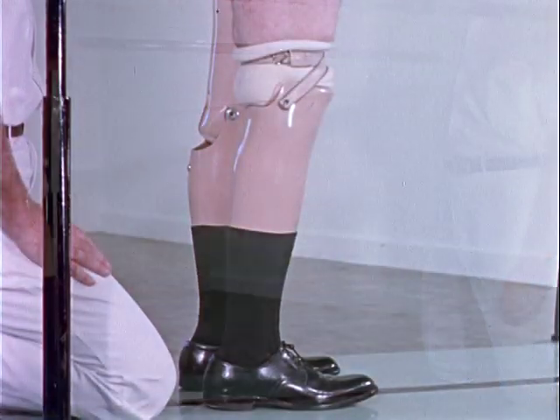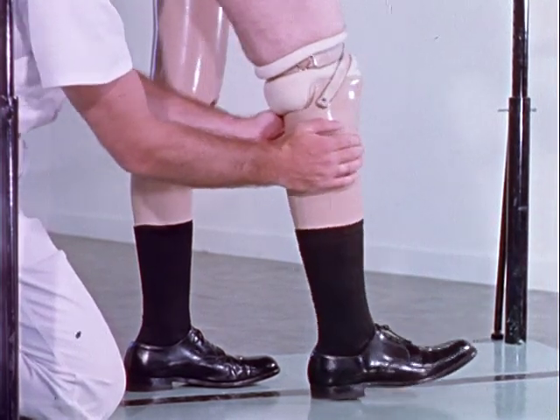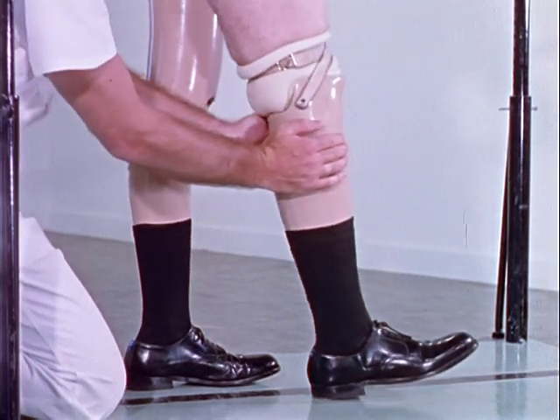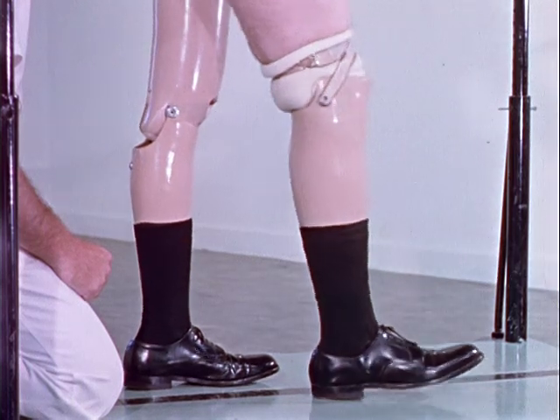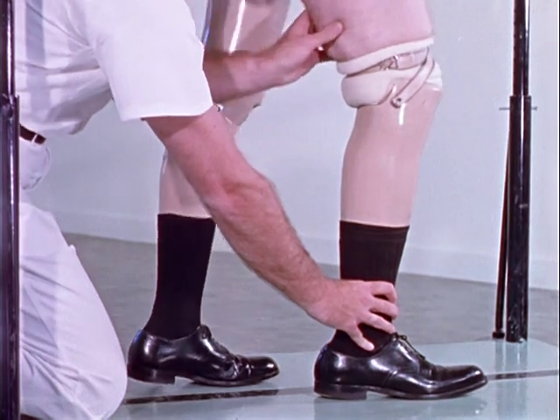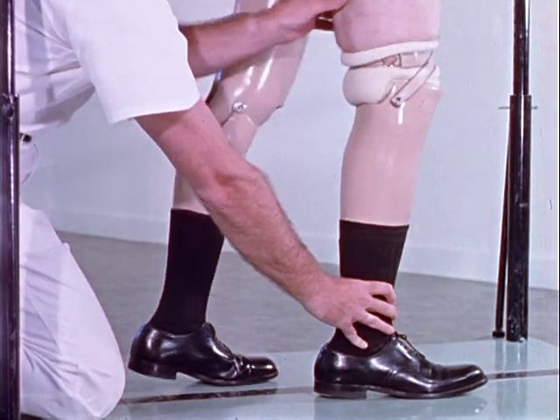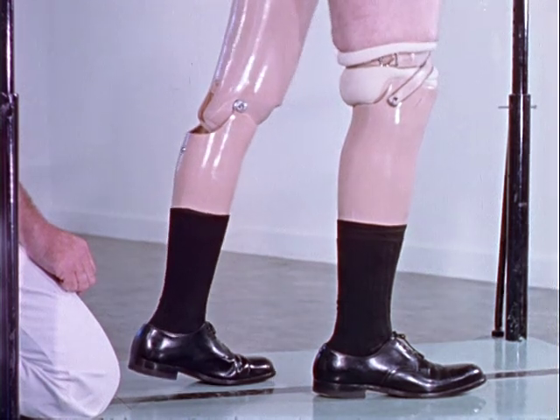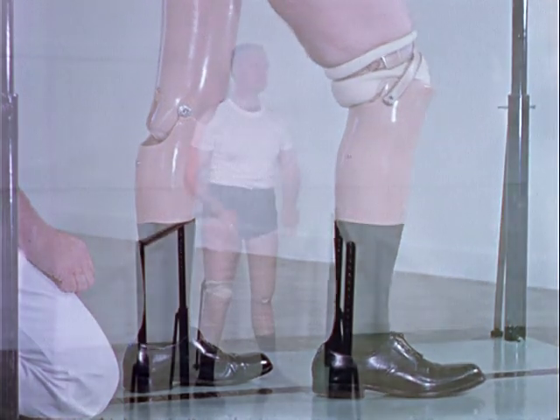There are also two basic skills to be mastered with the patellar tendon-bearing prosthesis. Controlled knee flexion from heel strike to foot flat must first be practiced. With the foot flat as a base of support, controlled knee extension as the body weight is shifted over the extremity is then practiced. Ball throwing develops balance.